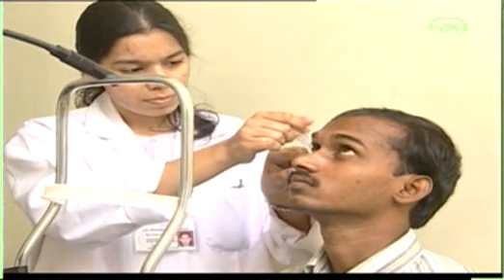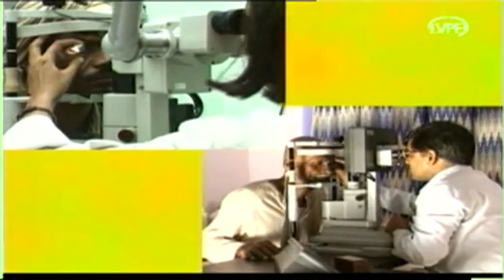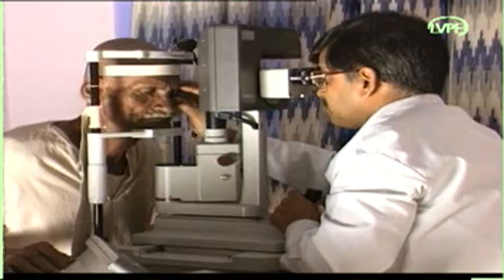Laser iridotomy is an outpatient procedure which can be performed under topical anesthesia. Two types of lasers are commonly used for iridotomy: the Q-switched Nd:YAG laser and the argon laser. The Q-switched Nd:YAG laser is preferred by many surgeons because it penetrates the iris easily.